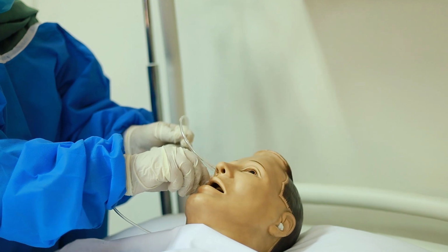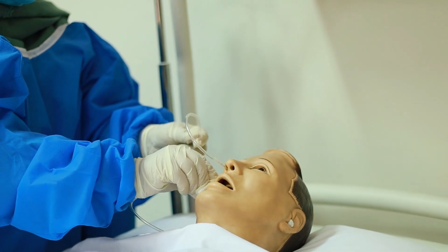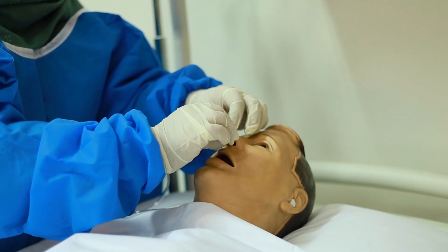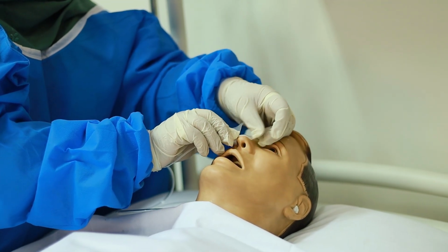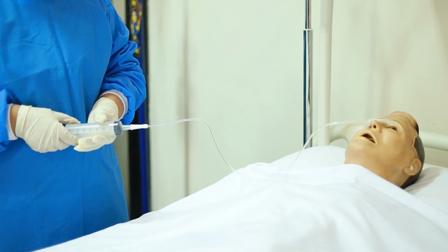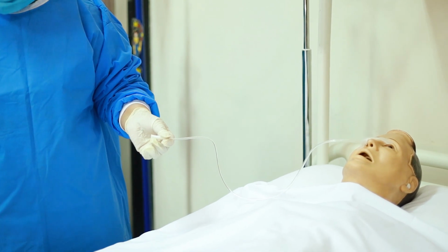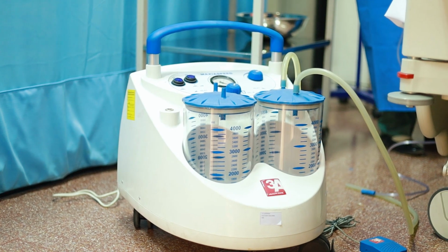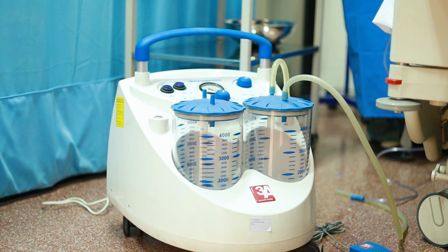Clean the area if there are any secretions. Then use the adhesive tape to secure the tube. If for suction, remove the syringe from the free end of the tube and connect it to the suction. Set the machine on the type of suction and the pressure prescribed.